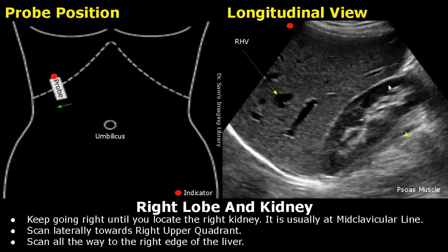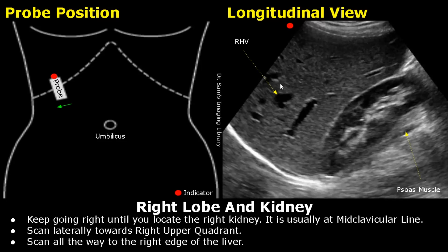Keep going right along the costal margin until you can see the kidney — usually it is seen at the mid-clavicular line. This is the right lobe. This is the right hepatic vein. We can see both the upper and lower poles of the kidney. This band is the psoas muscle. Scan all the way to the right edge of the liver. If needed, ask the patient to take a deep breath — this will push the liver below the ribs.